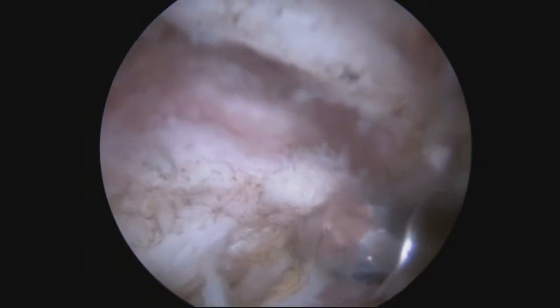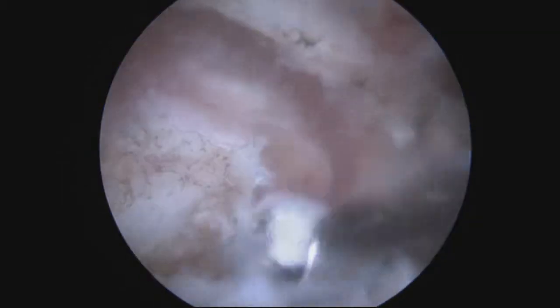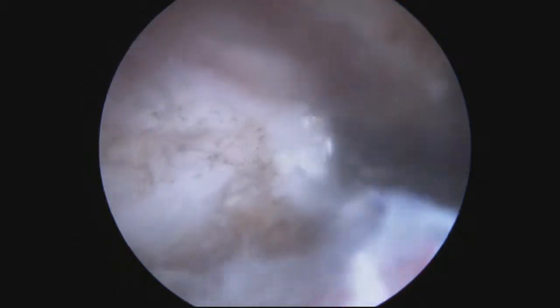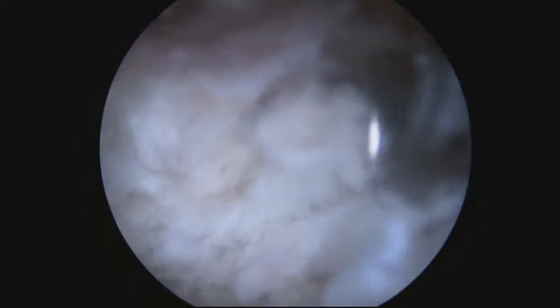We're going to bring in a burr — this is about 5mm — and take off about 5-7mm of the distal clavicle. We start by burring the trough to set the depth of resection, going all the way from the front of the clavicle to the back.